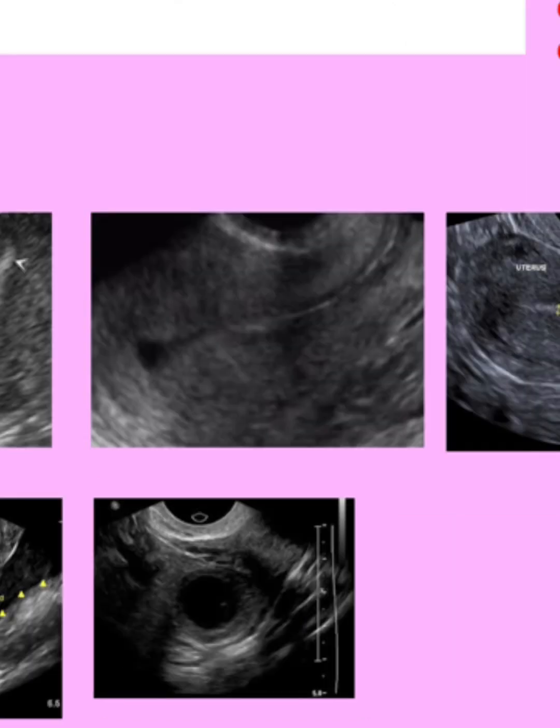Next, we see some fluid in the uterine cavity. We don't see an embryonic disc, we don't see a yolk sac. It is weirdly shaped. If the patient does have high levels of HCG, we might be seeing an early IUP, or this can also be associated with an ectopic.